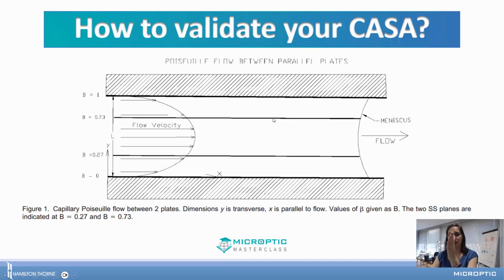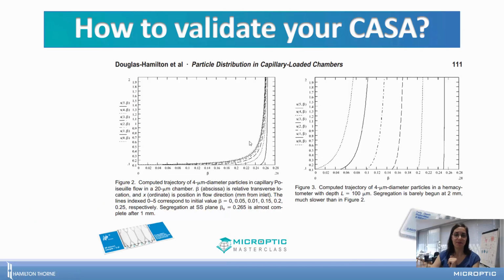This effect will result in the development of a meniscus in which a higher number of cells will be concentrated than those that we can find on other parts of the counting chamber. So the concentration on the meniscus will be higher than on other parts of the counting chamber.